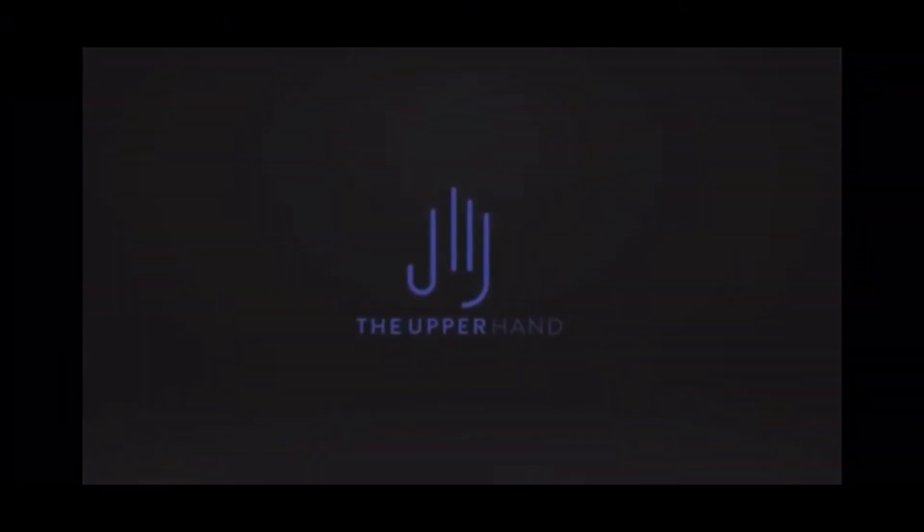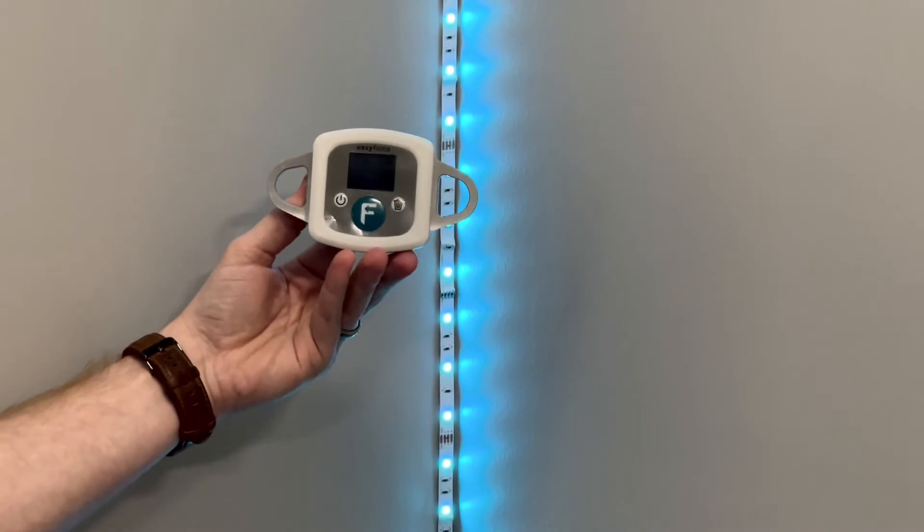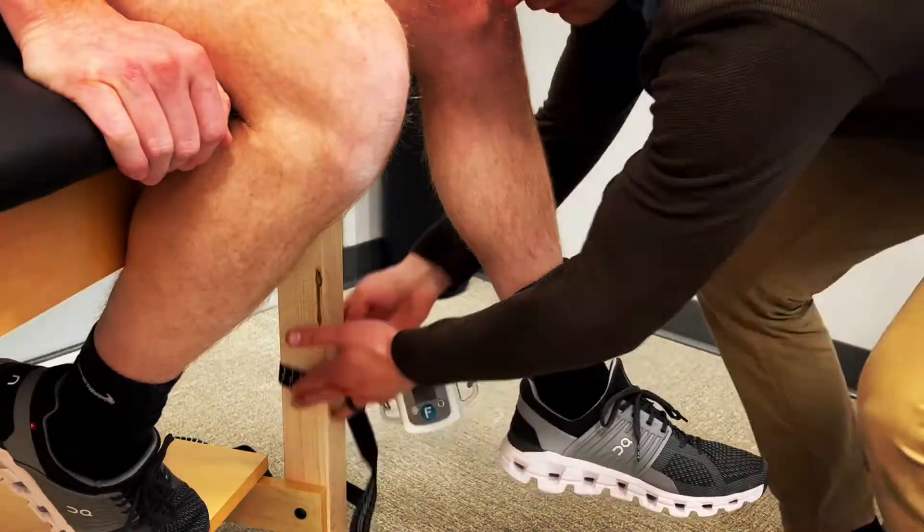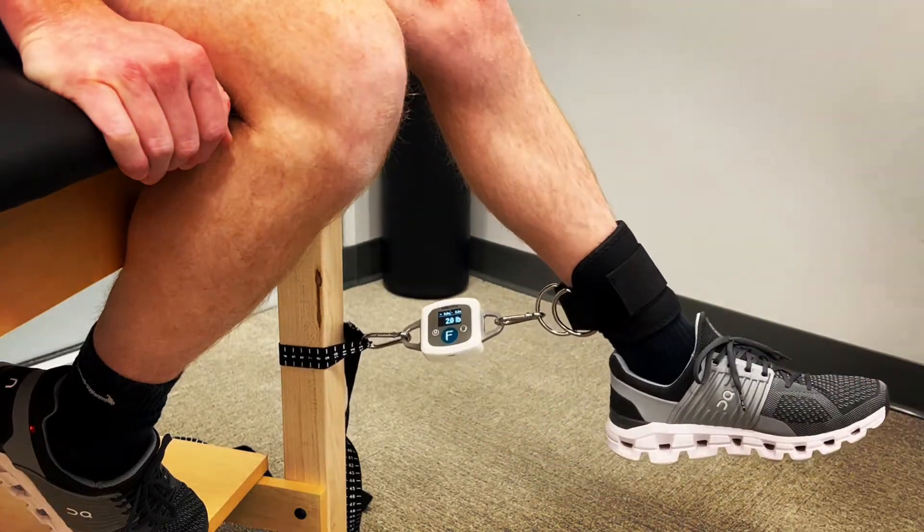The Easy Force — what is it? Easy Force is a digital dynamometer that takes the guesswork out of manual muscle testing. We often use the tired and outdated quick manual muscle testing assessment to assess someone's strength, but there's a lot of guessing and subjectivity in that. There will certainly be discrepancies between two different therapists. So if you want a way to accurately obtain objective strength measurements, I suggest you try this out.